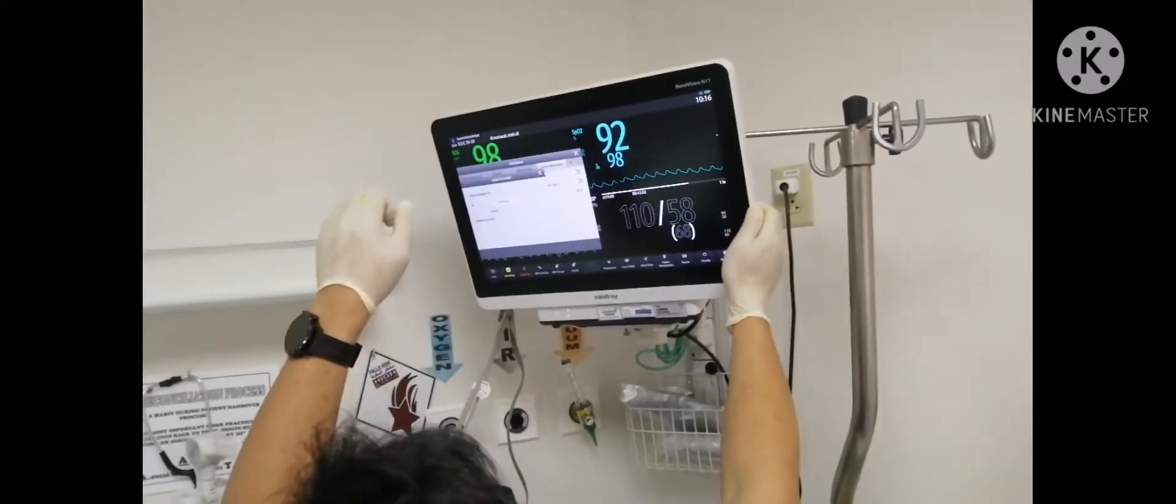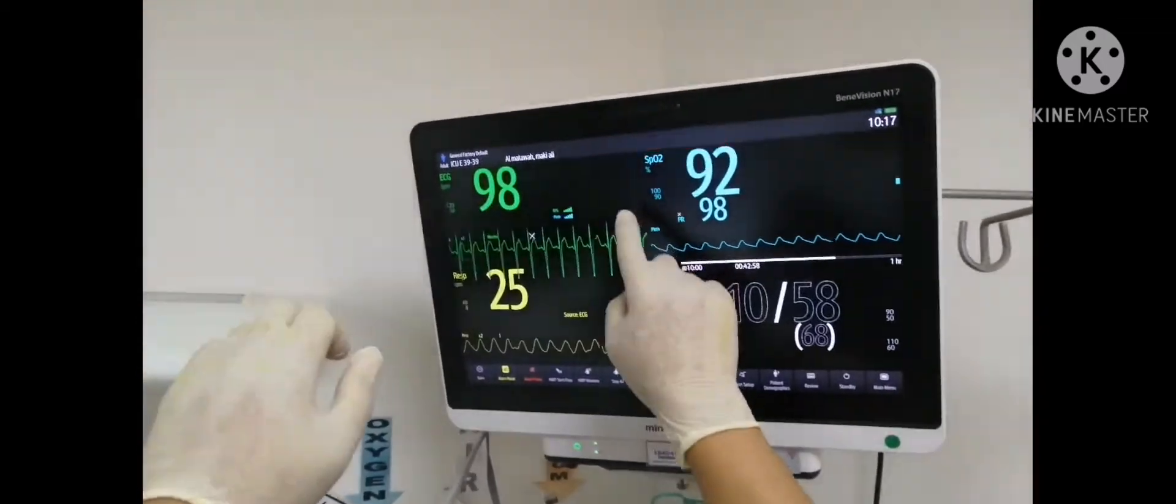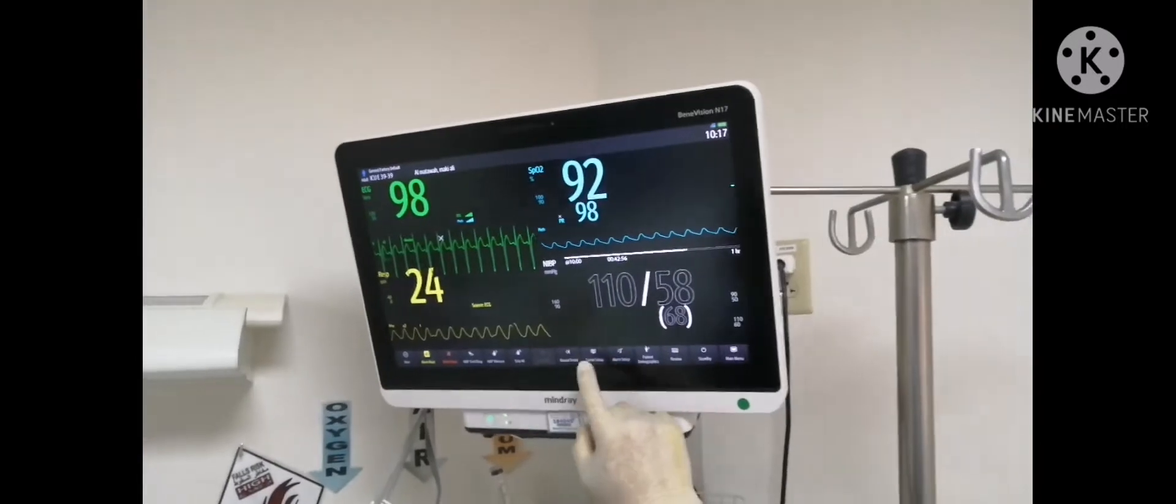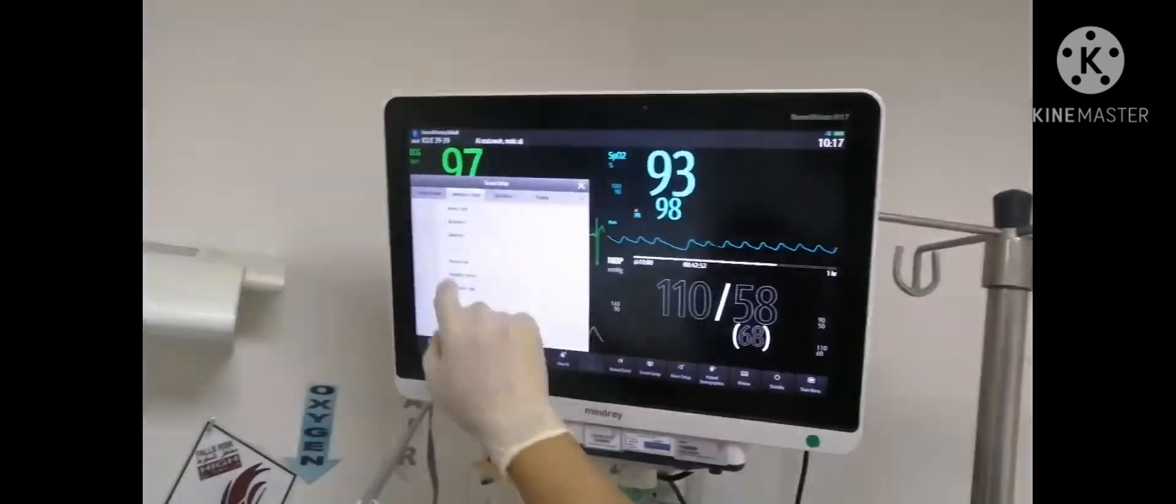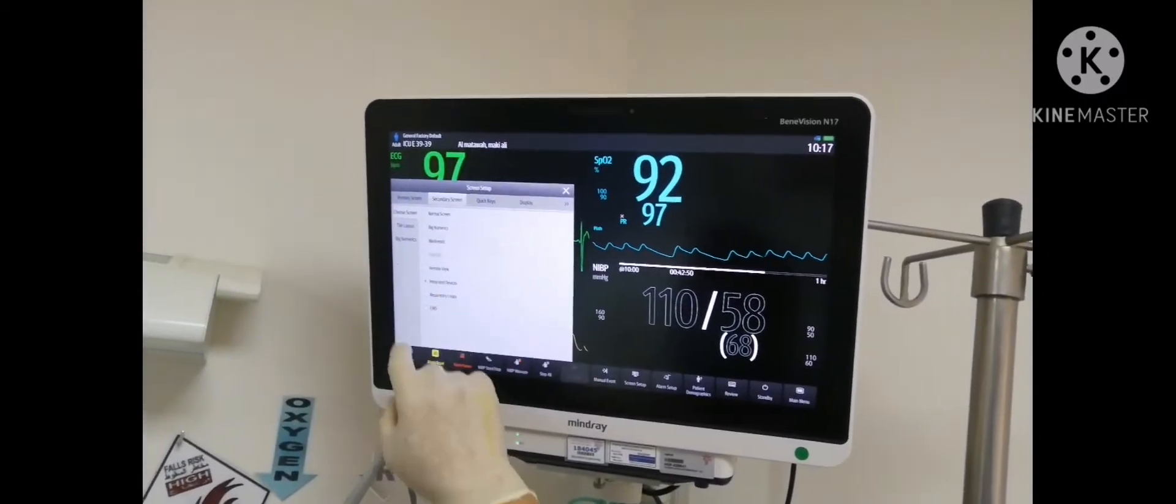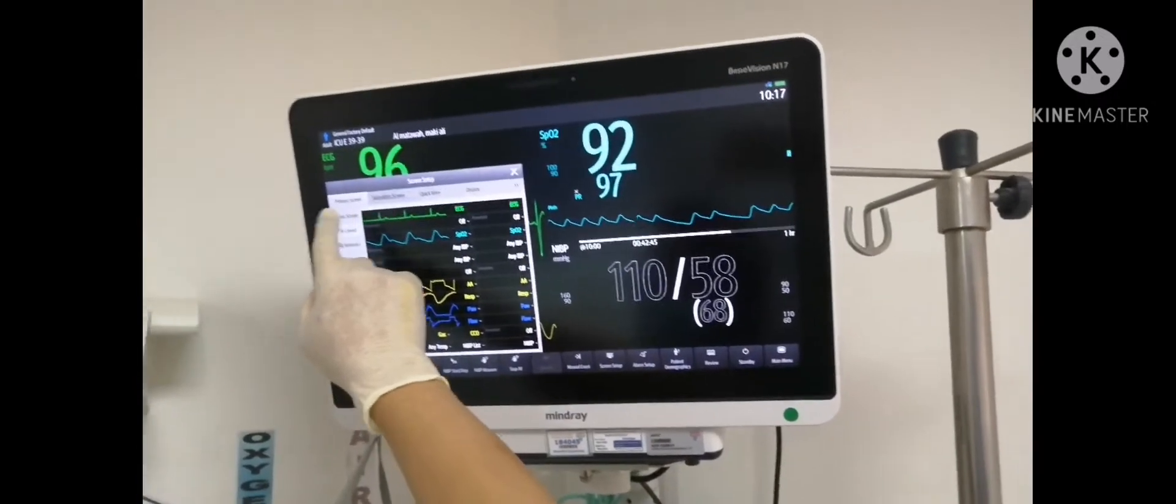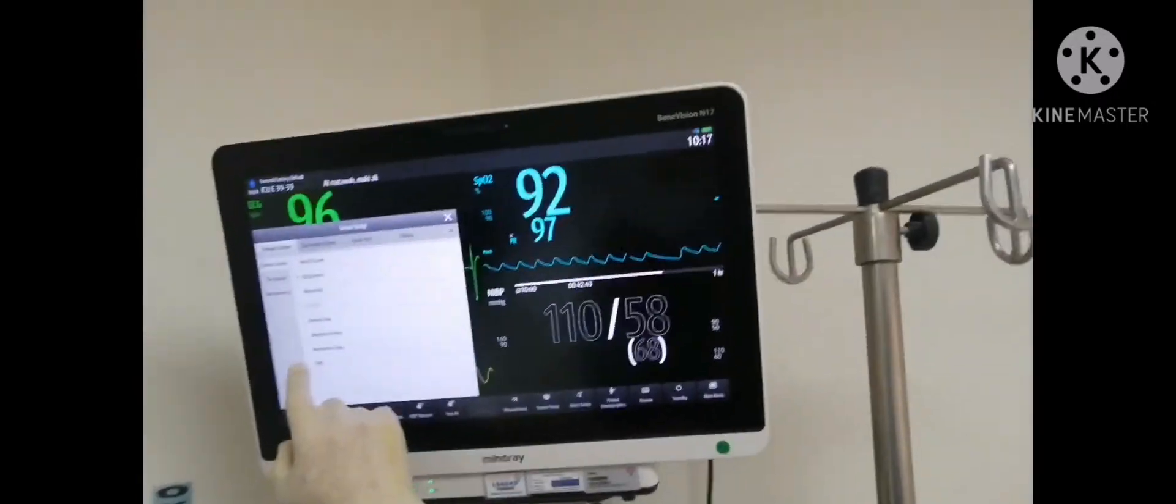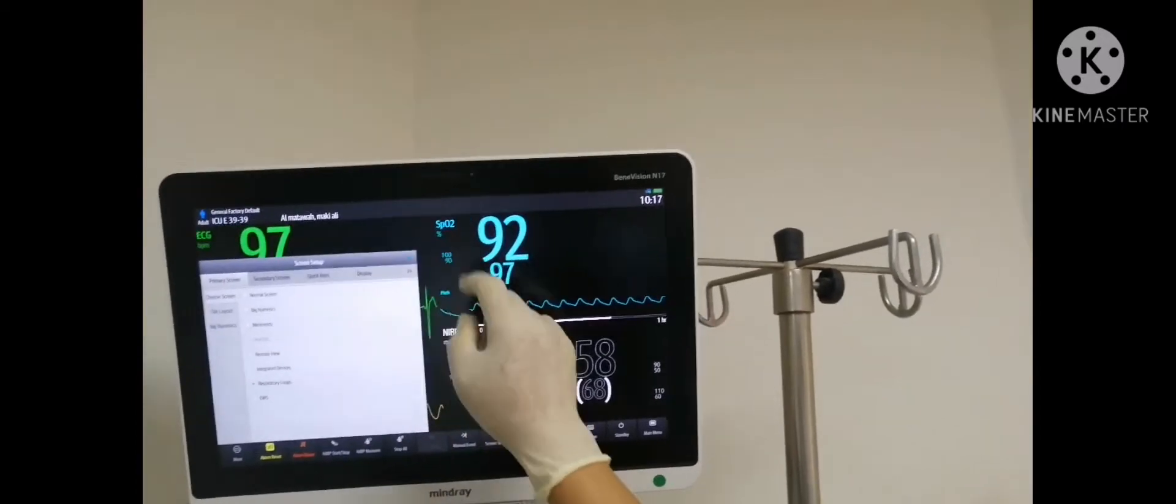Okay, 3D. Now it's confirmed. It's very easy. Go to the screen setup. Go to the secondary, make it integrated device. Then go to the primary screen. Choose, then make it loops. Respiratory loops. Okay.